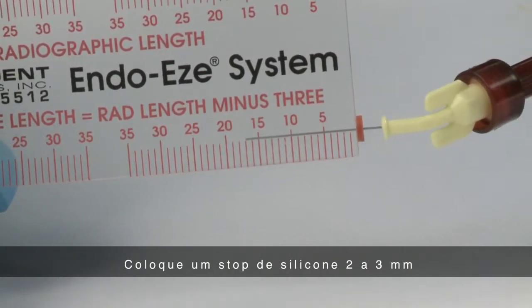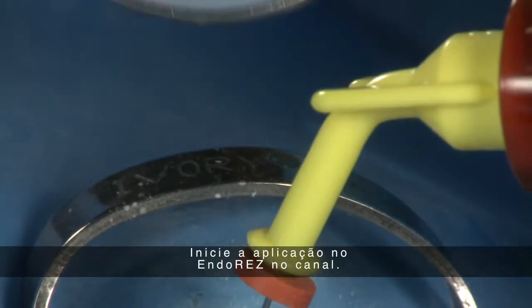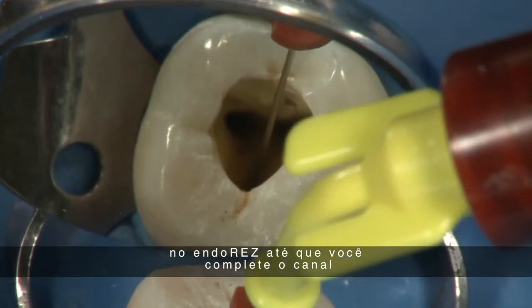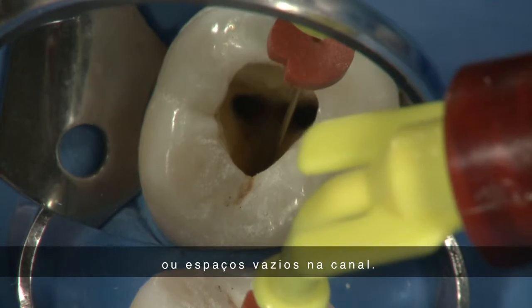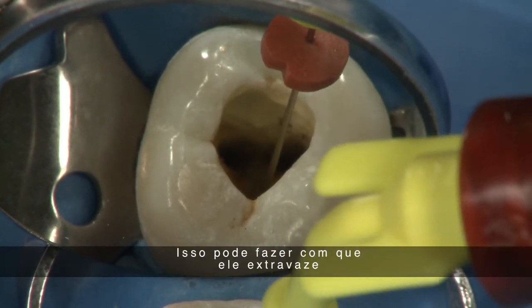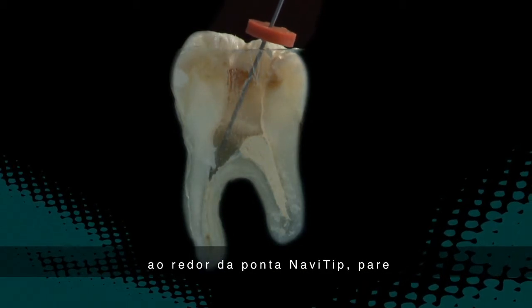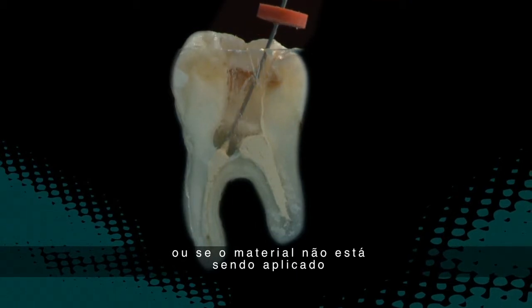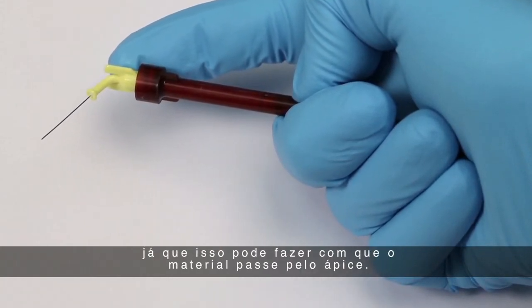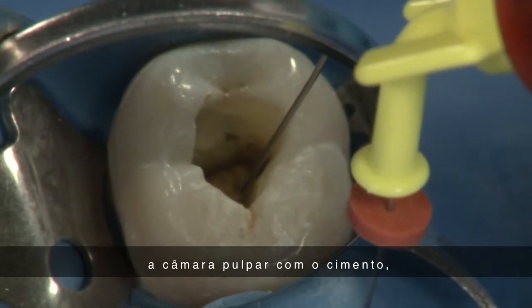Set the Navi tip's silicone stopper 2-3 millimeters short of the working length. Be sure the Navi tip remains 2-3 millimeters shy of the apex and does not bind. Begin gently expressing EndoRes into the canal — do not force the material out. Keep the tip of the Navi tip buried in EndoRes as you backfill the canal to eliminate the formation of air bubbles or voids. Caution: do not deliver EndoRes if the Navi tip fit is tight, as this may express EndoRes beyond the apex. Do not use excessive force on the skinny syringe plunger. Stop filling the canal about 1 millimeter short of the canal orifice — there is no need to fill the pulp chamber with sealer, as cleanup will be more difficult.